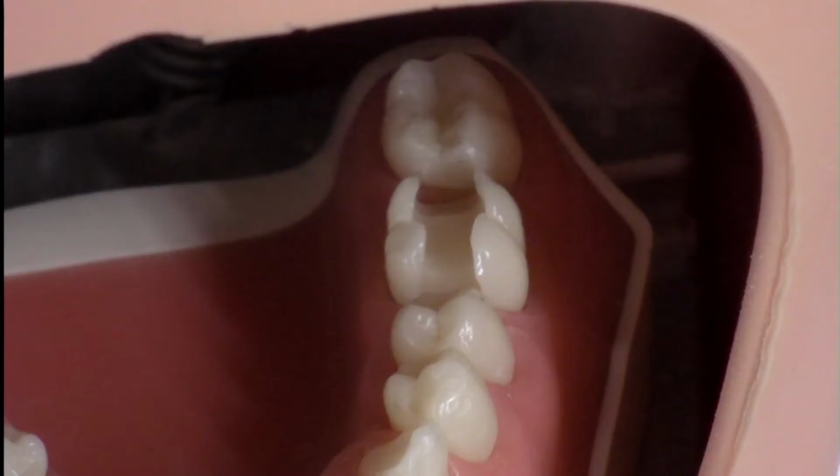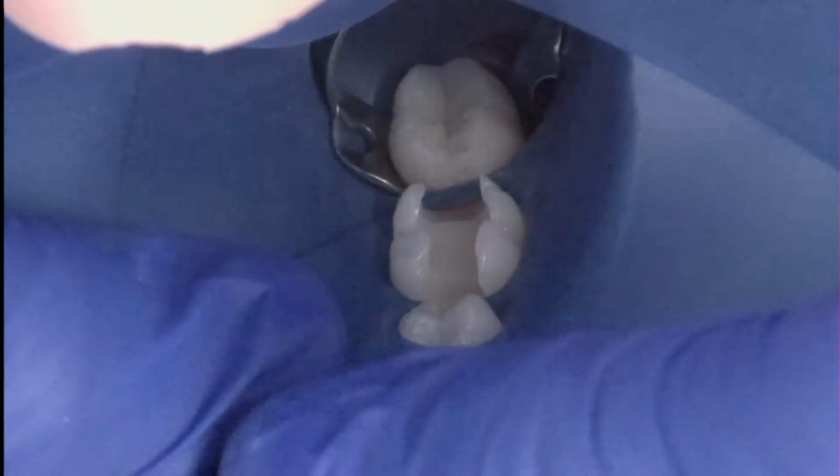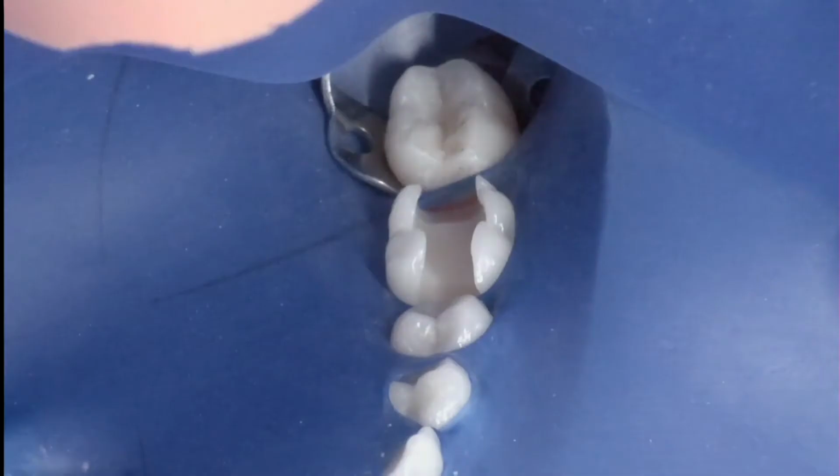Hello and welcome to my video about a large MOD composite restoration. This situation is kind of like if you had a large amalgam restoration, the patient had a crack in it, you had to remove it, but they didn't want a full coverage crown. So this is an alternative methodology to it.